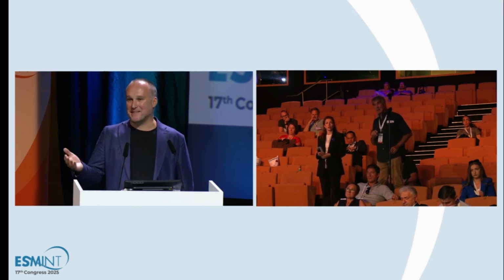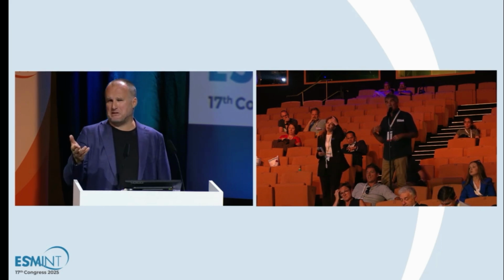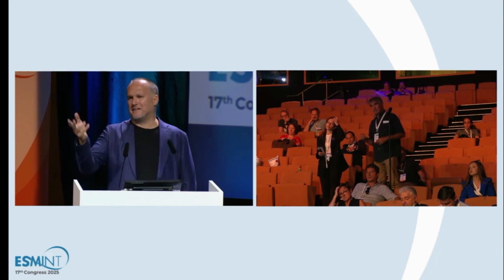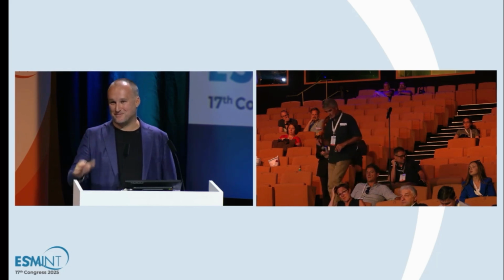We were expecting that. We were afraid that it will happen because the 10 minutes was too long. We put something like 8 coils there, and we were like, let's check if something happens. So the effect was what we expected.